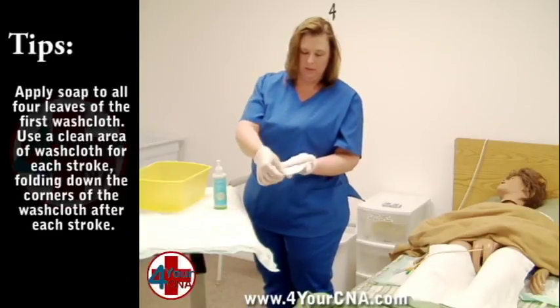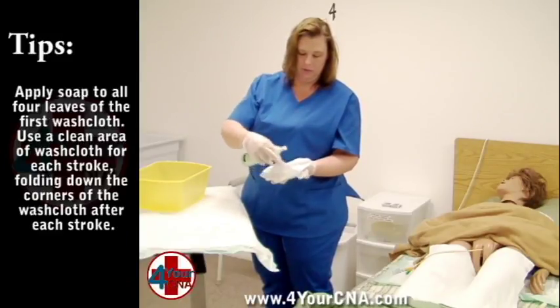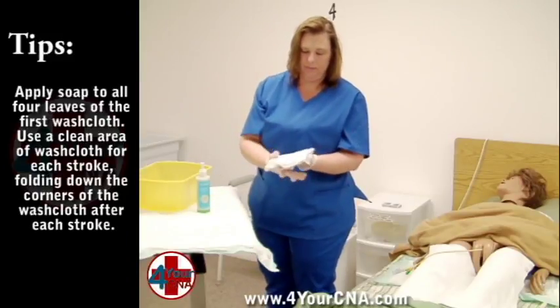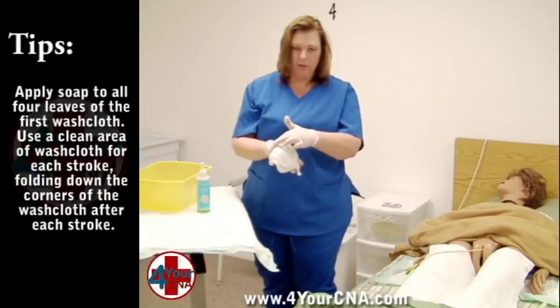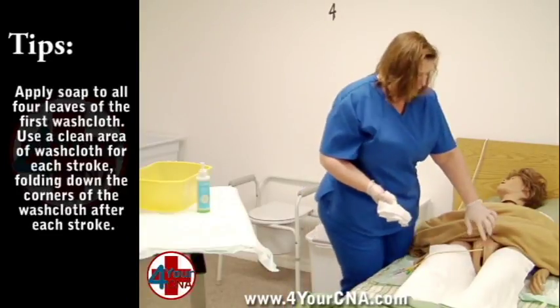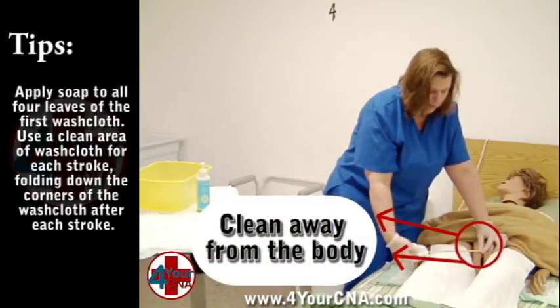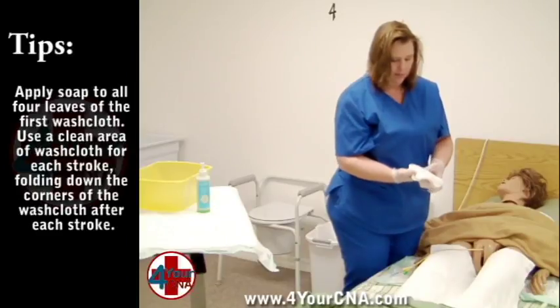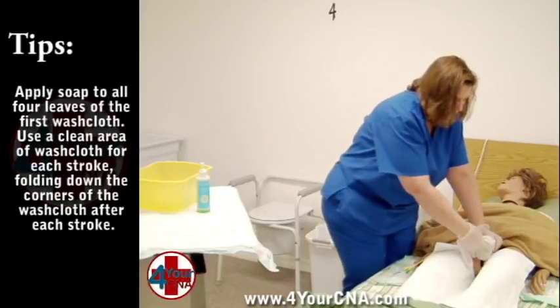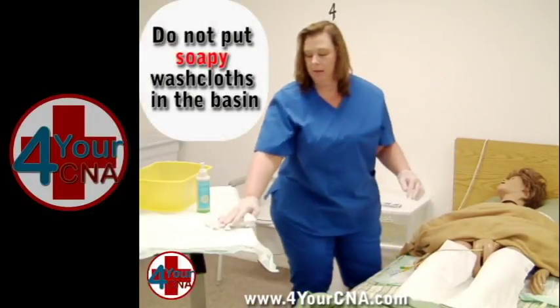You will apply soap to all four leaves of the washcloth. Tuck the two side corners between your fingers for better control. Explain to the patient what you will be doing. Hold the catheter with your non-dominant hand where it is inserted into the body, and starting at the catheter insertion point, wrap the washcloth around the catheter and wipe away from the body at least four inches. Fold the corner down. You will repeat this process with the following three leaves. Set the washcloth to the side.